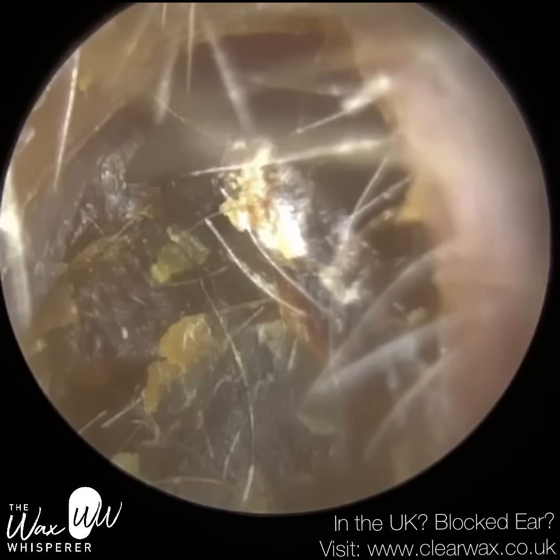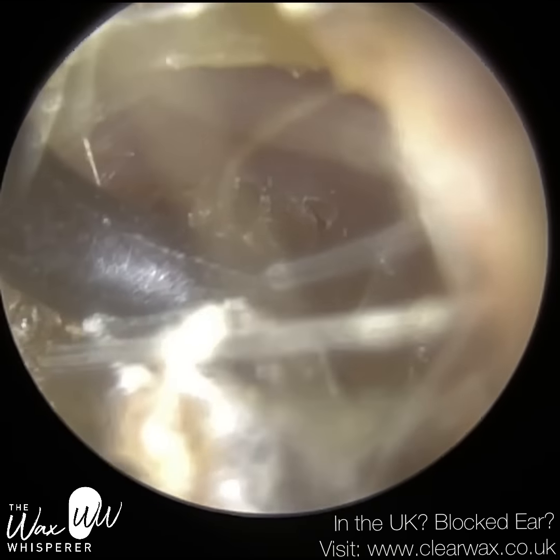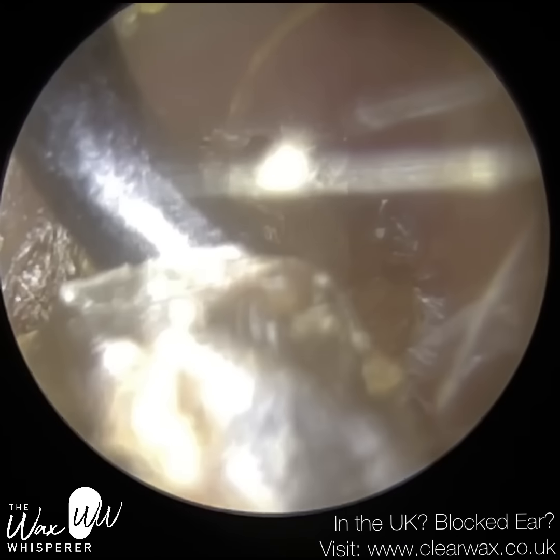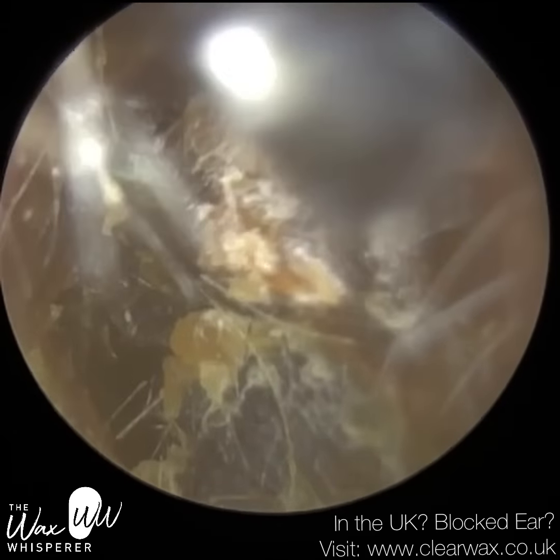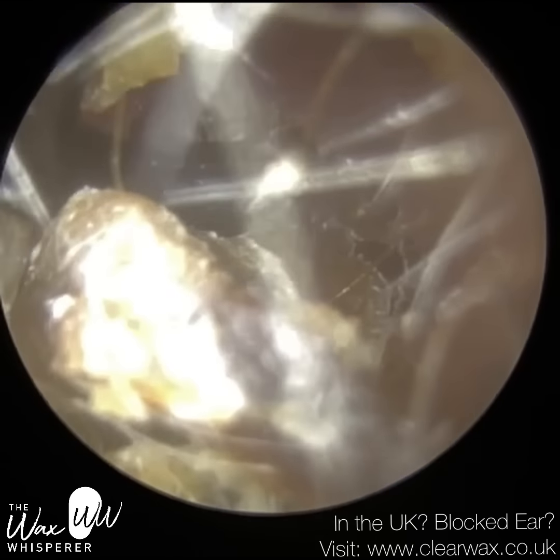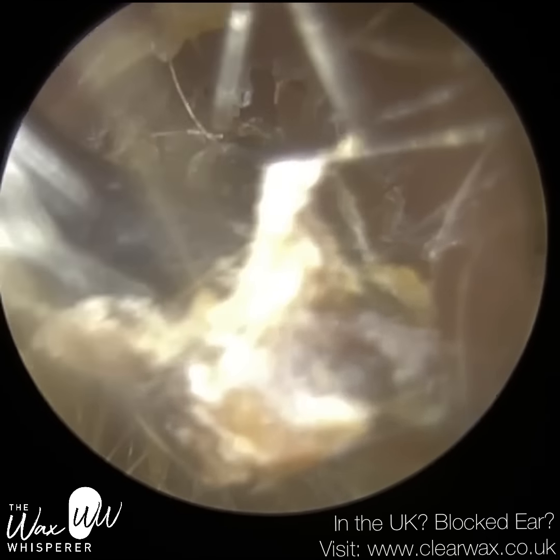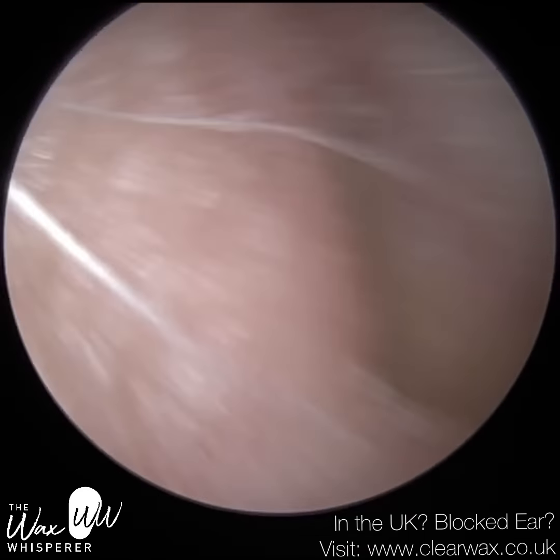Fortunately, there's an opening at the roof. I'm just going to get the hook behind. I'm going to leverage this slowly forwards. But it was quite dry and almost stone-like, and you'll see I can't embed the hook anymore. As I was attempting to, the hook just moved away towards me. So you've got to be careful. We don't want that. You don't want to be losing control of that hook where it's flying away into the ear, to the side parts of the ear canal.